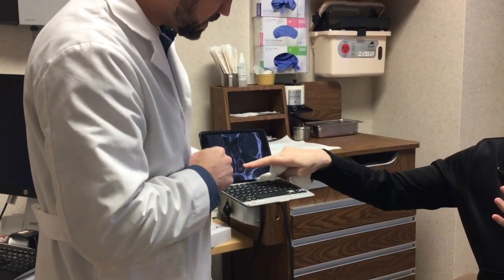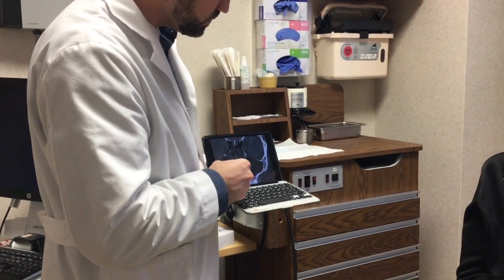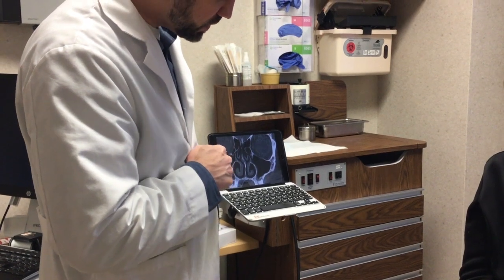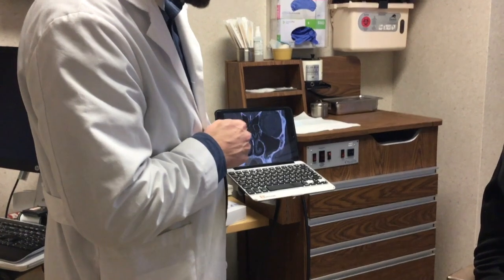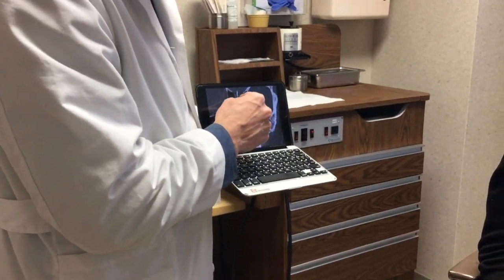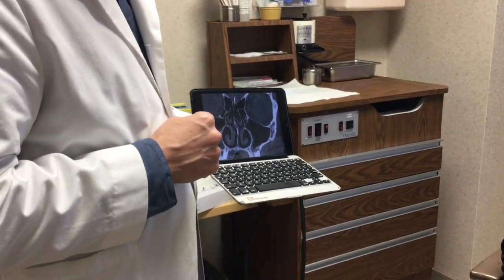And these are? These are the turbinates. These are the ones at the bottom. At the bottom, okay. Yep. And this is where we put the balloon, here and here. So the balloon's going to push this ethmoid air cell in so it's not blocking the opening on both sides. And then the ethmoidectomy is where I removed a small piece of bone here to also prevent that from blocking that normal drainage pattern.